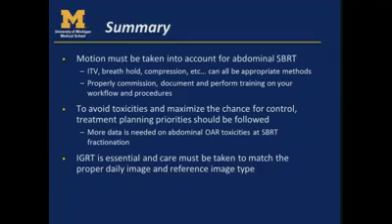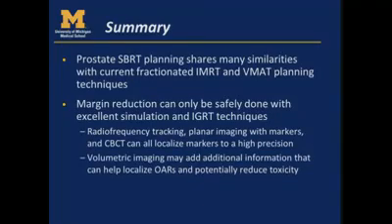You want to follow strict treatment planning priorities, and we really need to get more data on abdominal OAR toxicities because that's one of our limiting factors in dose escalation. IGRT is really important, and you want to make sure you're pairing up the right image of the day with the right reference image. And prostate SBRT planning, of course, we think shares many similarities with current fractionated techniques, in that margin reduction can be done safely, but only with really good IGRT and simulation and immobilization techniques.